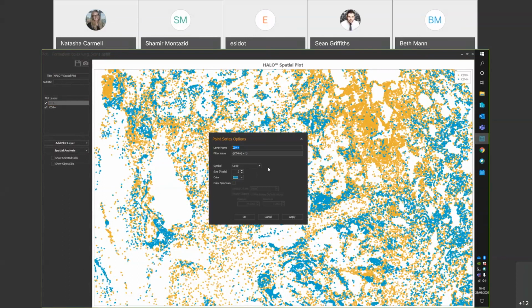And if you are wanting to overlay any spatial analysis on top of your biological image, which is something we'll look at shortly, you won't be able to change the colour once that markup's generated, so it's important to do it before running any spatial analysis. And from past experience, I typically find that the 3 pixels for this particular image might be a little bit small, so I might want to increase those just to make it easier to see.